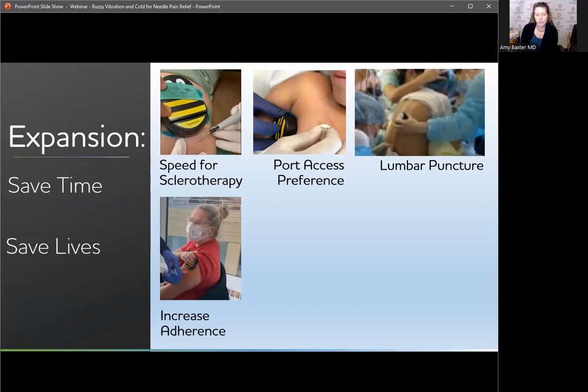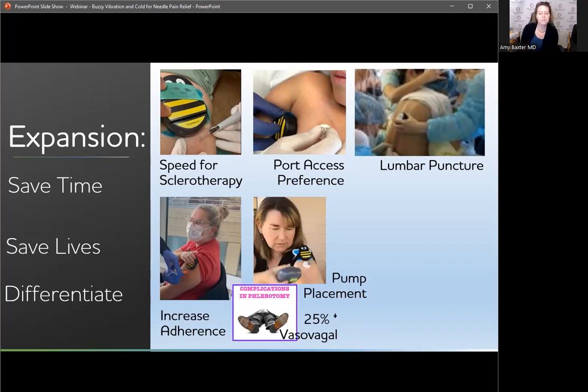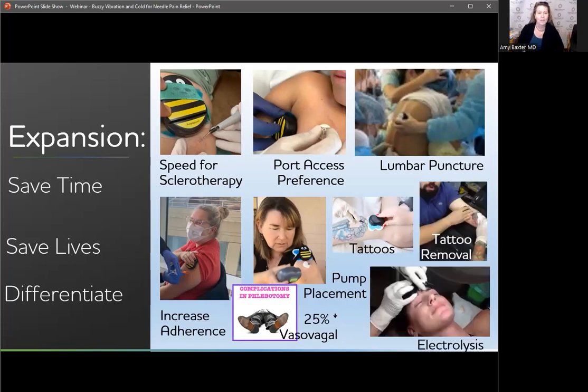During COVID, it was used not just for pain relief, but also to improve adherence for patients who either had problems with fainting or people who were afraid of needles and needed to have a mechanism by which they could get over that fear. So pump placement for glucometers or for continuous glucose monitors, and then for cosmetic tattoos, tattoo removal, and electrolysis. Any procedure that is going to take a long time. So anything where you're going to have multiple small painful things over and over again.